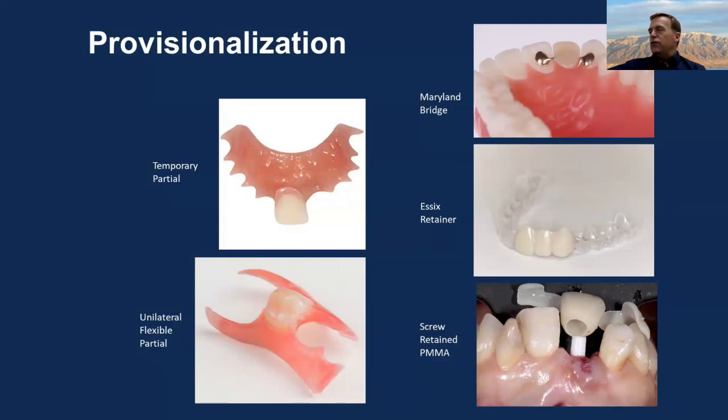And so then when the surgeon places the implant, usually you're doing these for singles, so you want to make sure that the clocking's just so in the guide. And then you can screw in the provisional. This has got to be way out of occlusion. It's got to be 0.5 millimeter out of occlusion in any movement, because it'll make the implant fail if we put it in function.